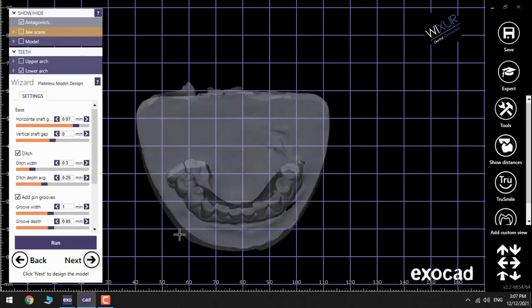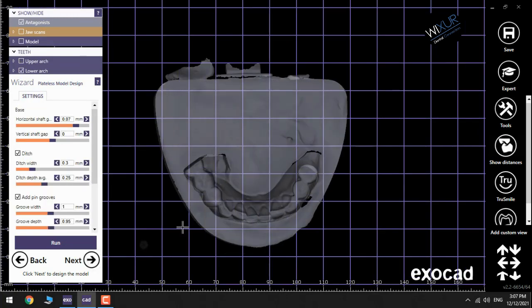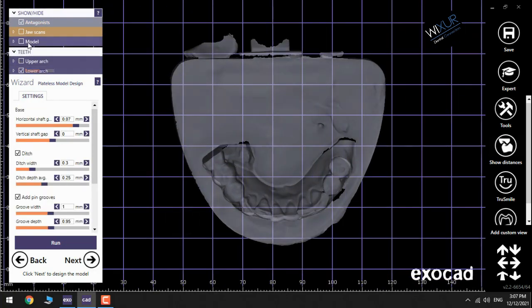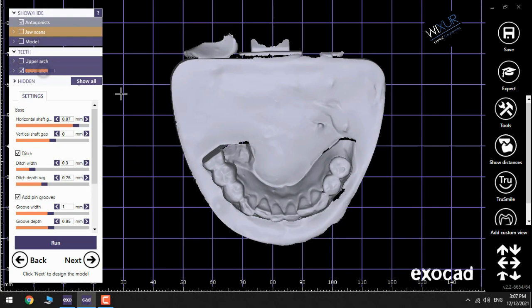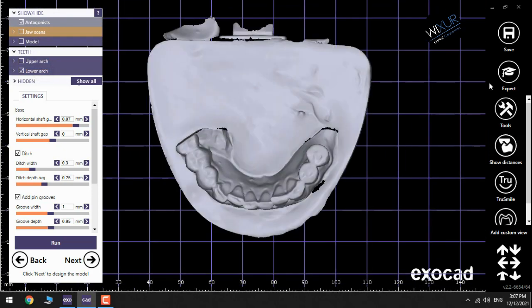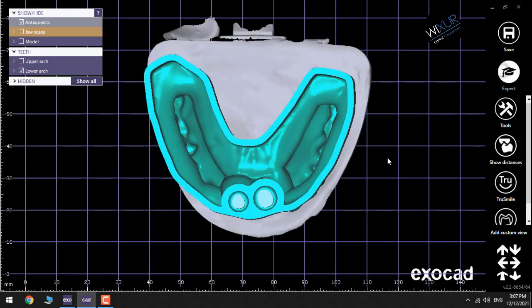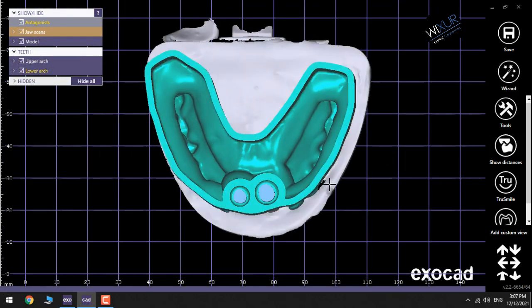Now it's time to do the same for the lower jaw by going to Expert, Scan Data Editor.